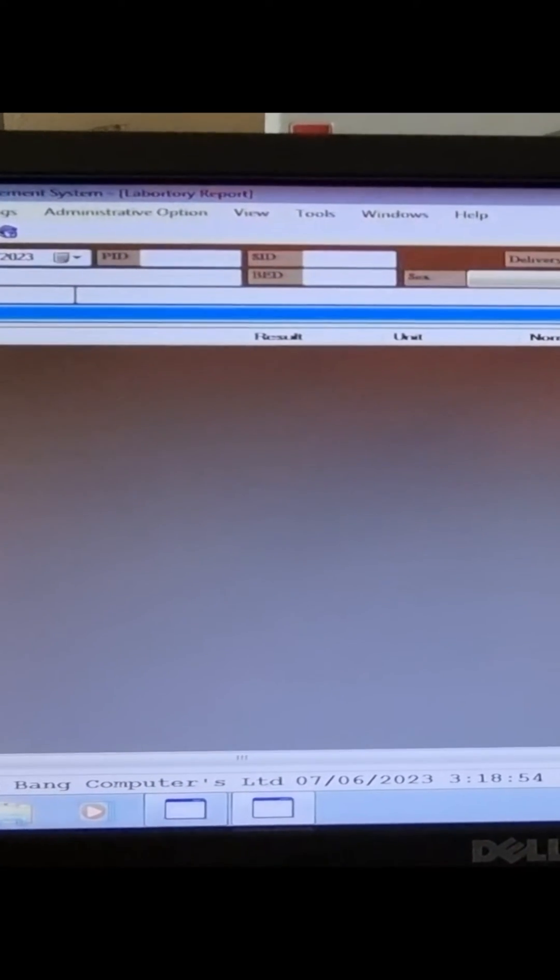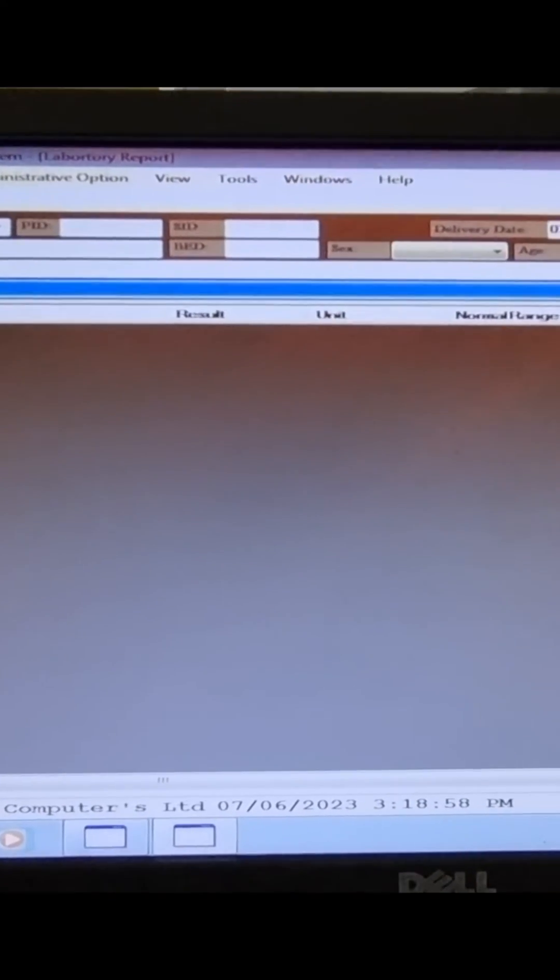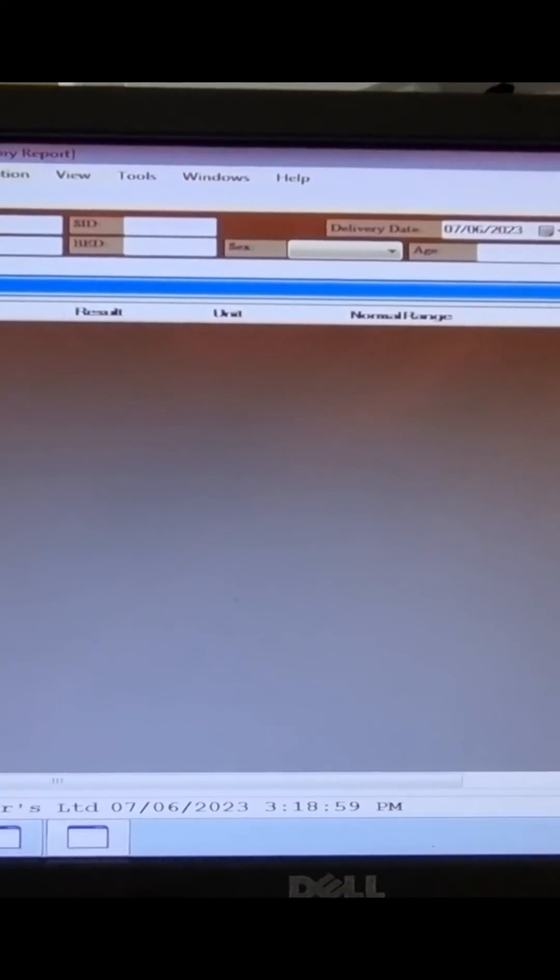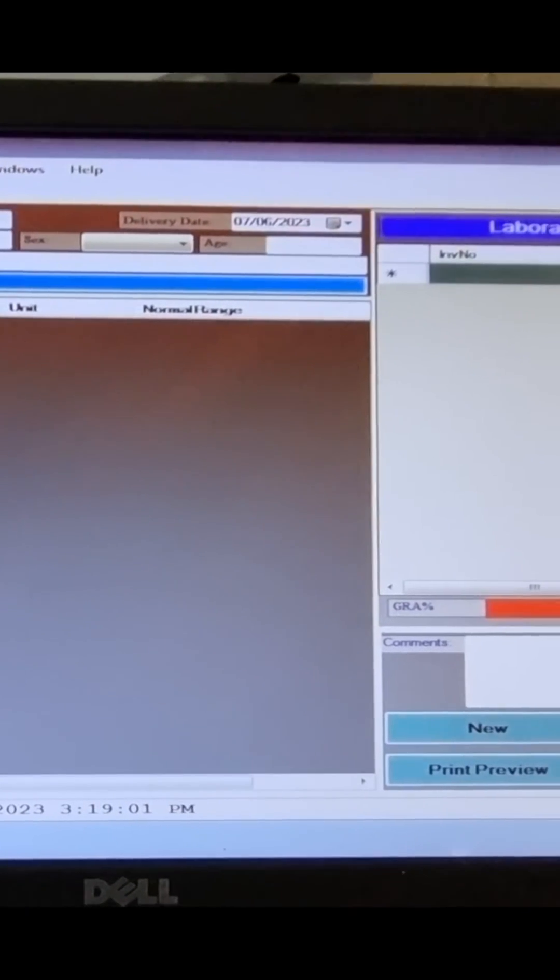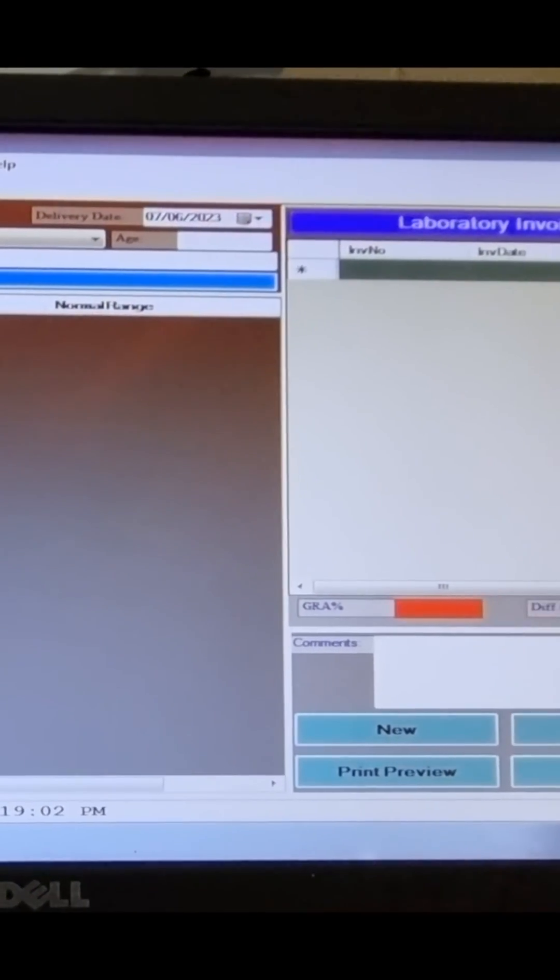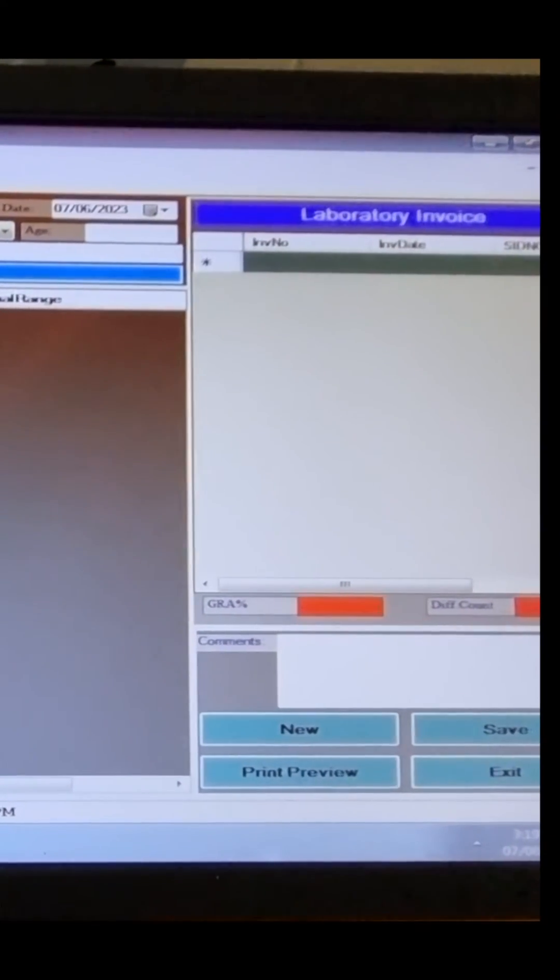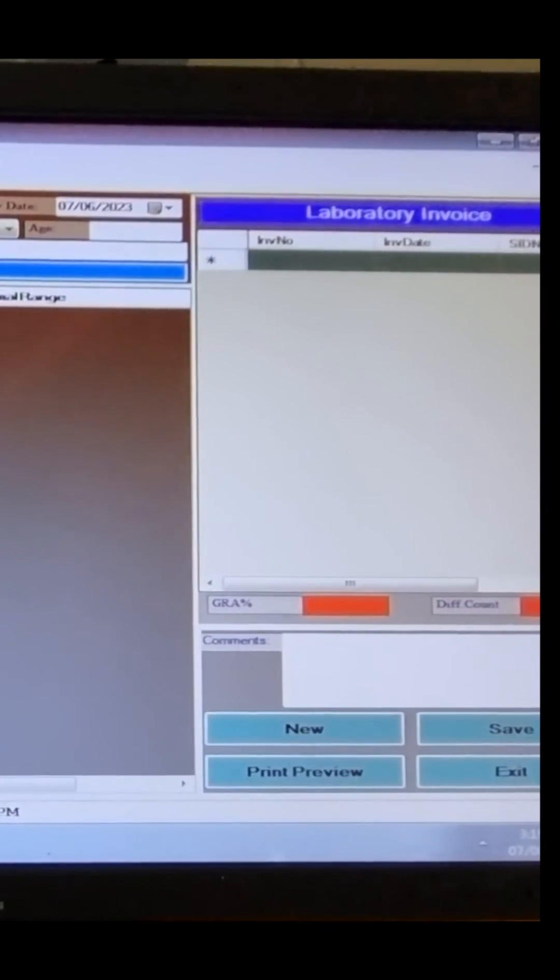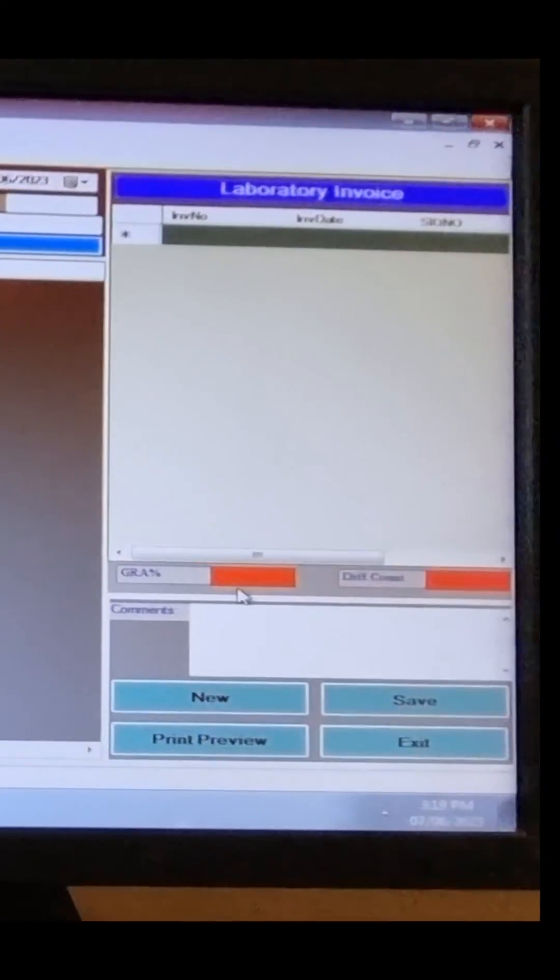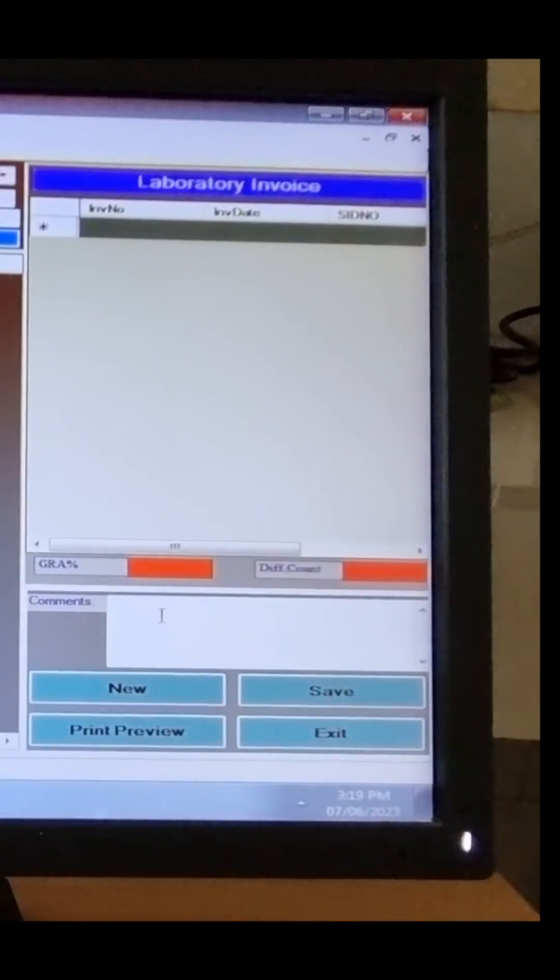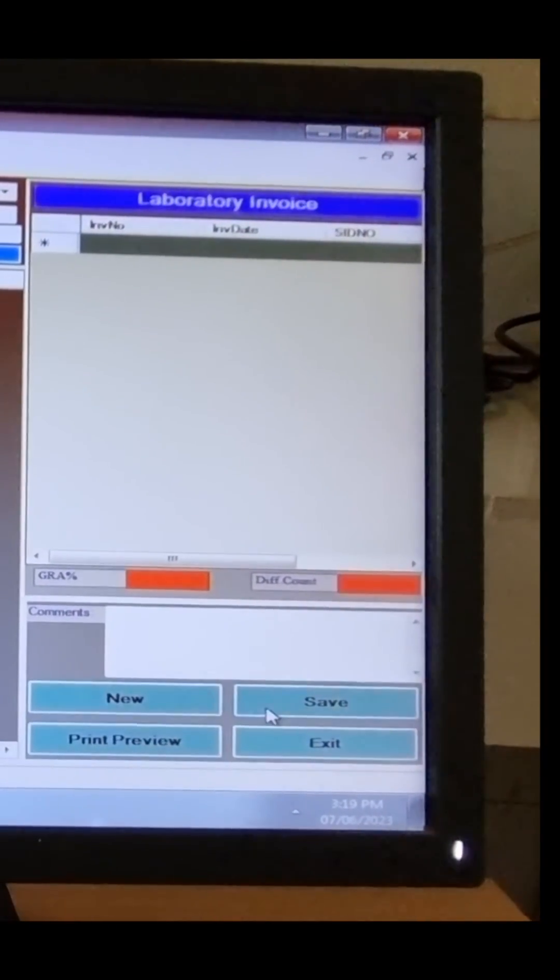Now we have to insert the ID number and PID numbers. Now we will press the lab report button to complete the results. At this point, our result is ready and we can see it by clicking print preview.